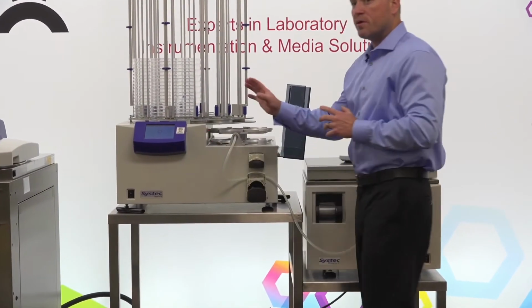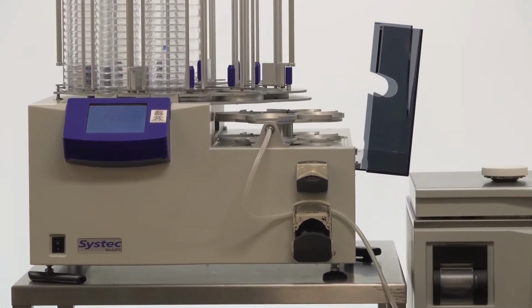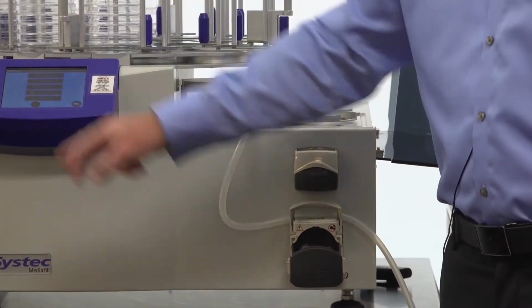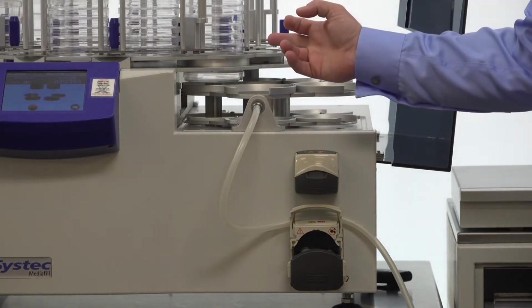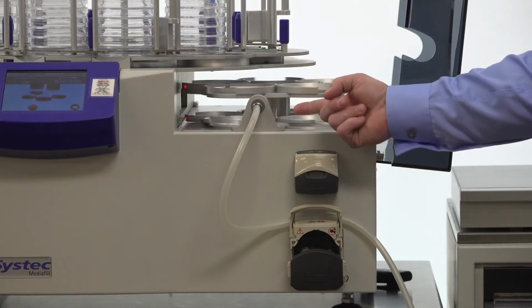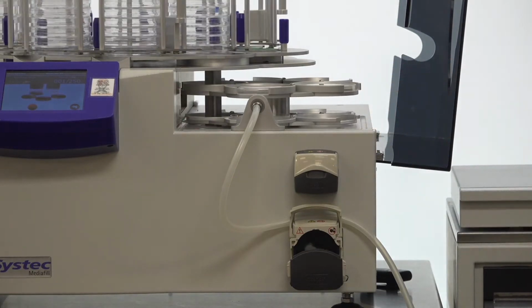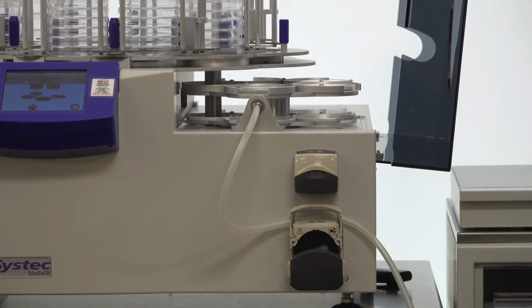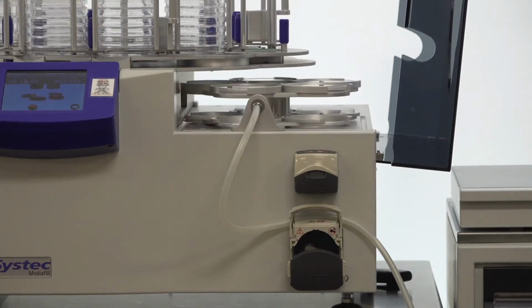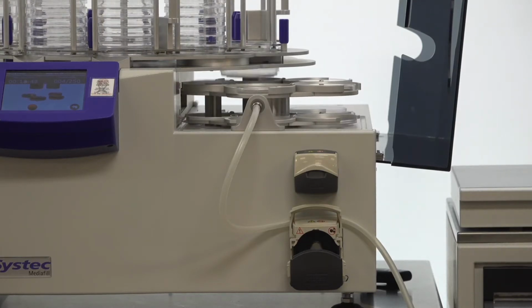And again, we will go through some of this programming once we've finished viewing this portion. If I'm ready to go, I can just simply hit go. Then our plates are going to start to be shuttled through. So the plate will be loaded into the unit. Then once it gets to this area, our pump will turn and that plate will be filled, and then will shuttle through and then be restacked into the carousel. The system is rated at roughly 750 to 900 plates per hour, depending upon fill volume and the rate of speed that you're processing through with the unit.